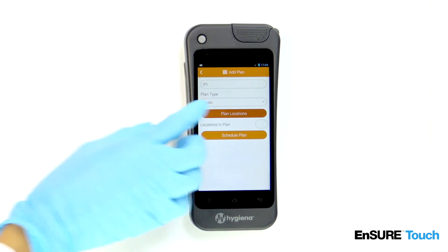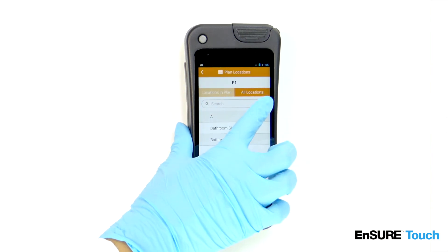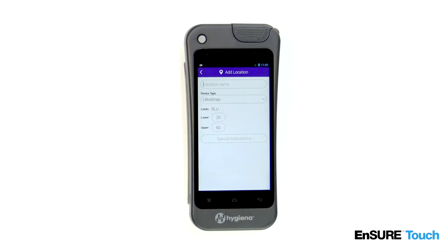If you want to add a location that doesn't already exist, simply touch the add symbol. Enter the location name. Select the test device type.